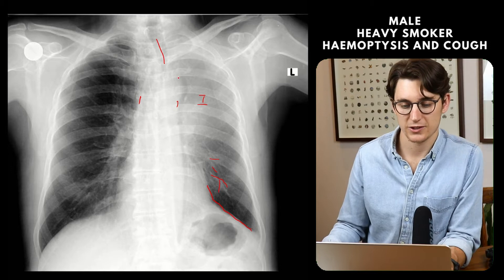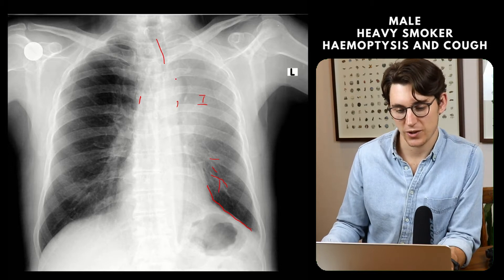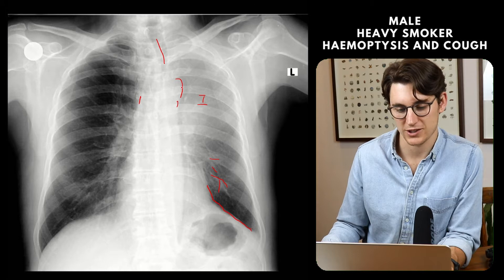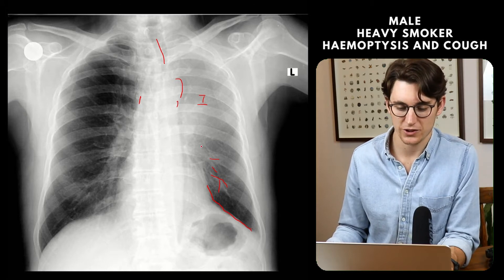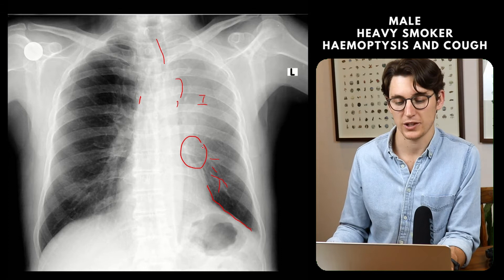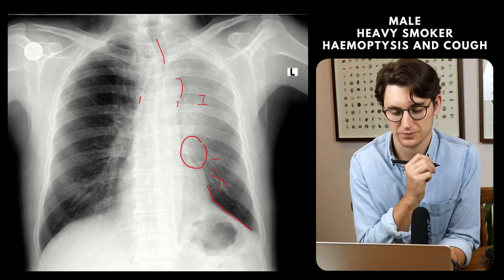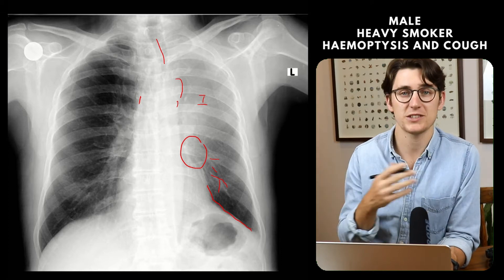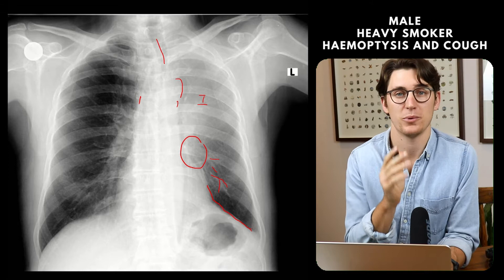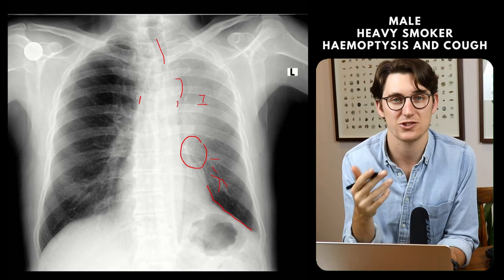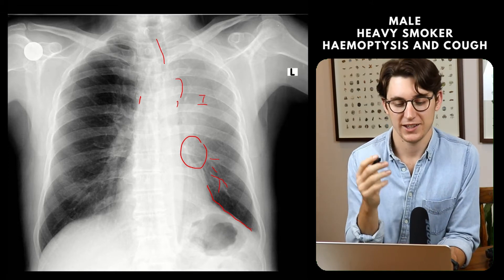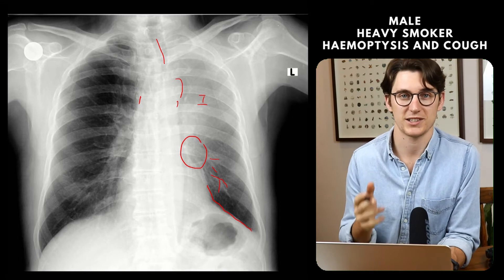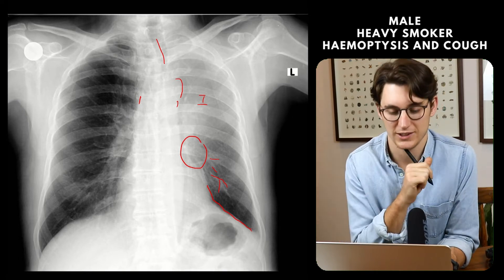There's a luftsichel sign with this accentuation of the lateral border of the aortic arch by this lucency here, as well as silhouetting of the superior aspect of the left heart border by the opacity itself. These features are in keeping with left upper lobe collapse, and given the patient's history and clinical presentation, the likely cause is an obstructing mass or malignancy in the lung.